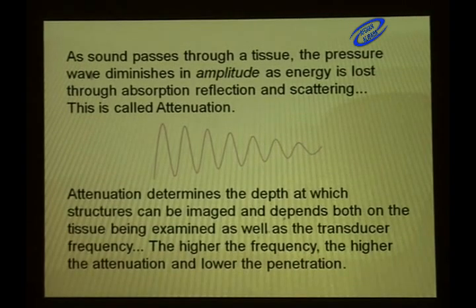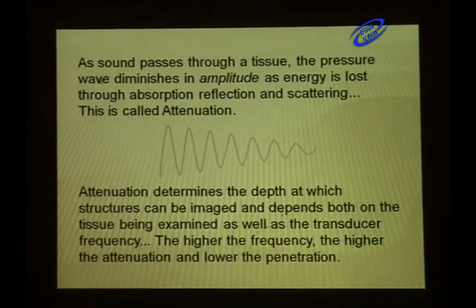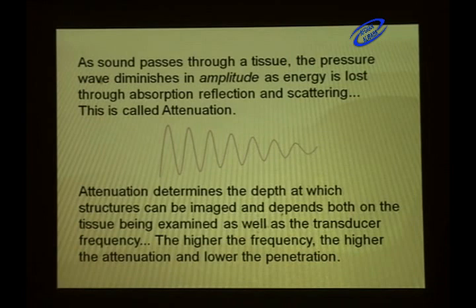An organ which is very dense like the liver, which is a heavy and large organ, obviously when the sound waves are passing through the entire depth of the liver, there will be attenuation of these sound waves. The higher the frequency, the higher will be the attenuation and lower will be the penetration.